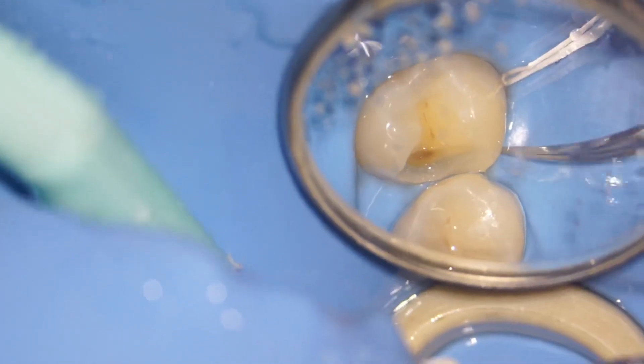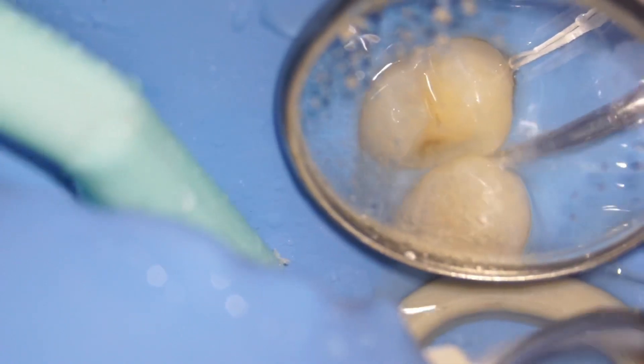As we are already going to fill up the whole tooth, let's just use the opportunity to remove any additional caries as needed, and definitely break the contact with the adjacent tooth so that your composite sits in a more cleansable position and is easier for the patient to maintain.